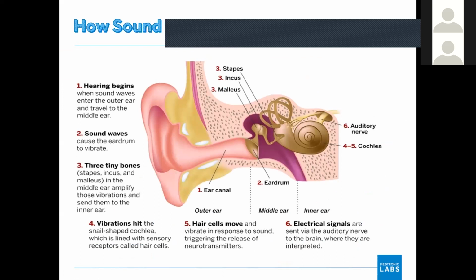So this helps us to understand very simply how the sound waves travel, what all the conversion forms are, where it reaches, and what all the parts' working procedures are. So again, I will quickly brush up the exact working and also the conversion forms for you.